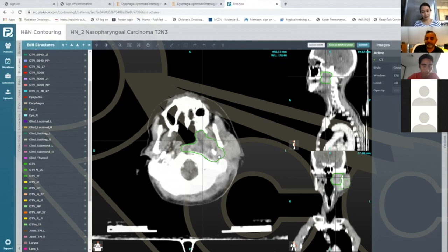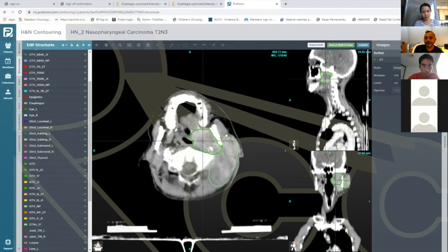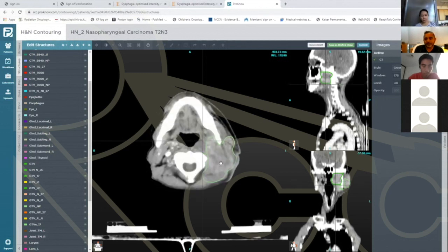This patient has disease going all the way to the mastoid and the occipital condyles and going back. So if I were to show you this, I would have contoured all this as nodal disease. I know this seems a little hard, but one slice lower, you can see all of this as cancer. This is all very bulky nodal disease. Even though we teach you nasopharynx cancer goes into the RP nodes and level 2 nodes, here's the sternocleidomastoid starting to come in down here. It can certainly grow into the deeper musculature of the neck, as it has here, going all the way towards the spine in this patient. This is all disease.